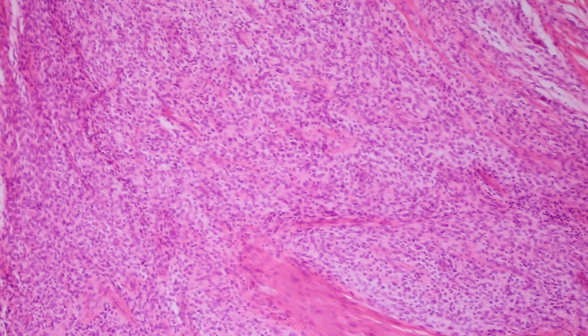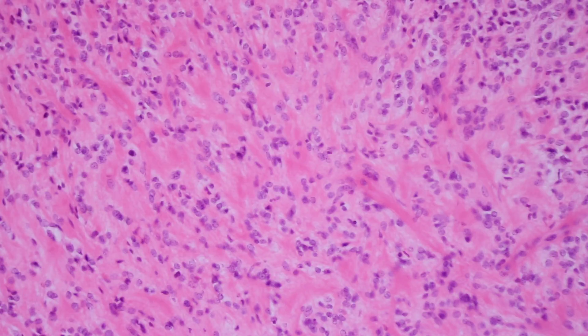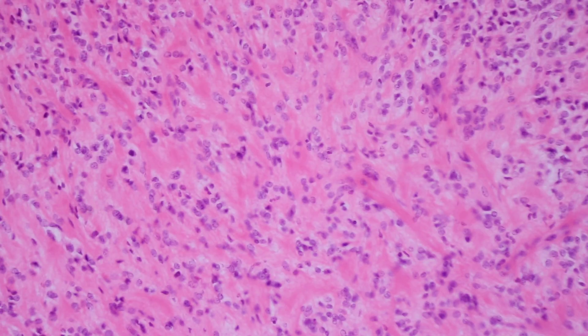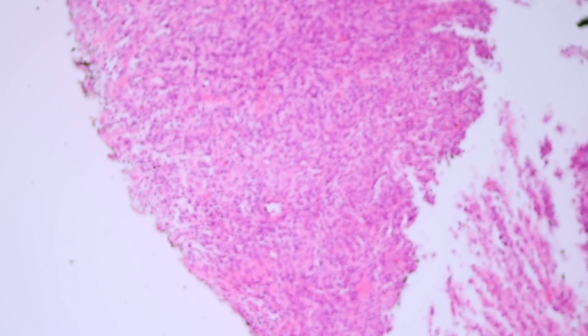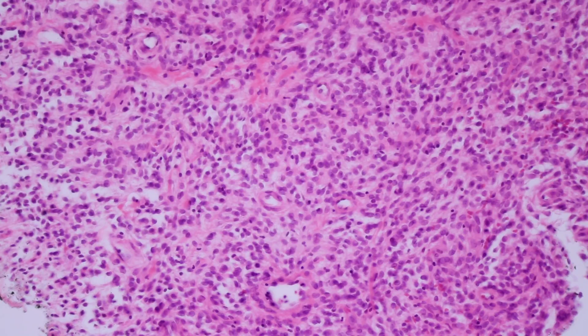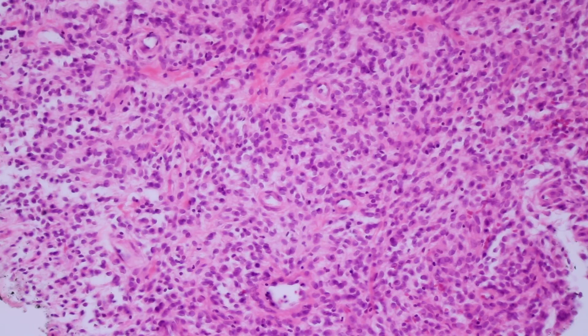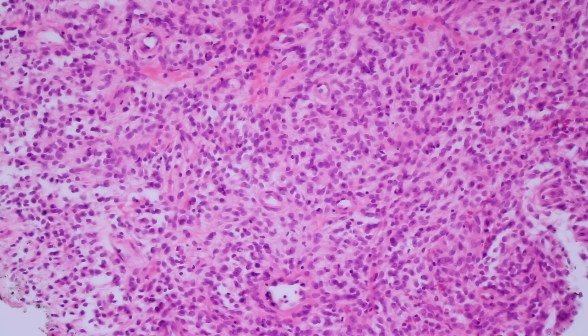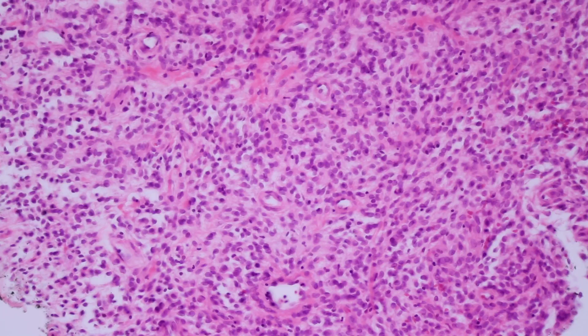The tumor cells are usually round to oval and sometimes spindle, but they're often more round or oval in shape. They're very uniform — they all look very much like their neighbors.